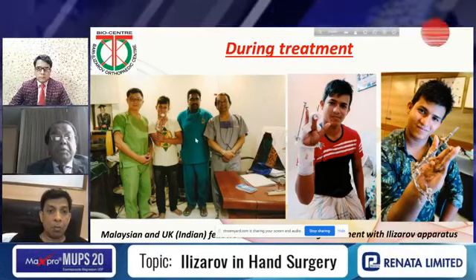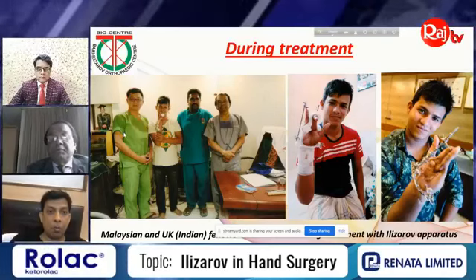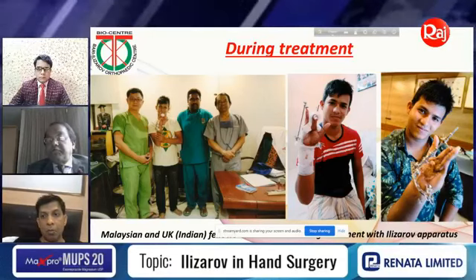Probably this person from UK, Indian, he had a Bijoy Bada. He was with me, and this fellow is from Malaysia. They did the fellowship here in my center, and this is the case with mini Ilizarov fixator.